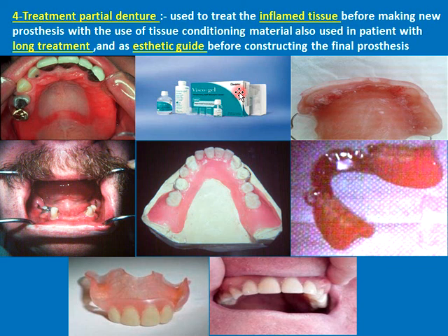The other use for treatment partial denture is when we have a patient like this with a lot of treatment in the lower jaw and the upper jaw، وهاي treatment might take months to be finished to occur more than one possibility for the treatment. يعني we end up in a nice partial chrome cobalt partial denture like this. Occlusion is corrected, bad teeth extracted, carious teeth حشيناها. Until we reach the final stage of the treatment we construct a partial denture اللي نسميه treatment partial denture.